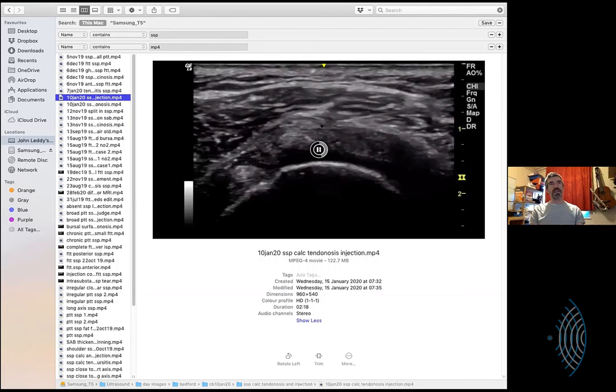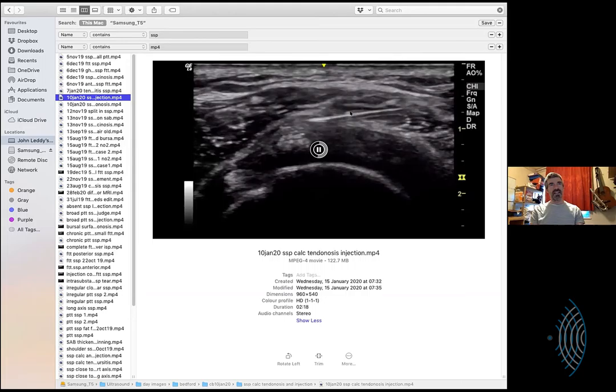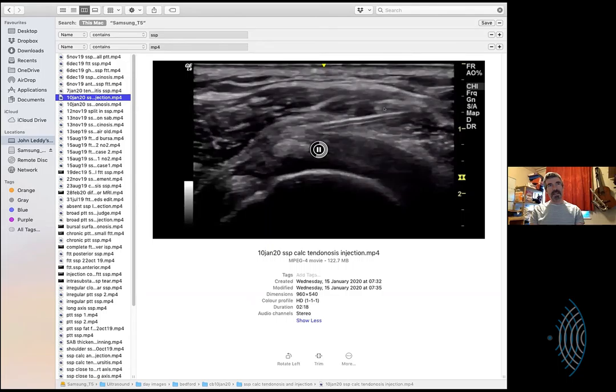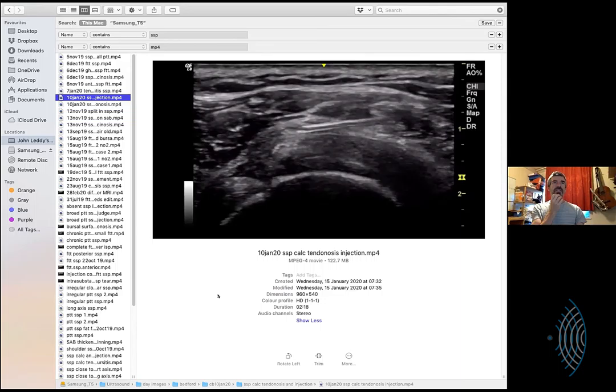And you're breaking through the bursa that's overlying the supraspinatus. I'm trying to find the bursal line, and this is one where I struggled. So I put it where I thought the bursa is, where that needle looks like it's in the bursa. But when I put the fluid in, it accumulates a little bit too locally, and so I'm not happy that that's actually in the bursa. That would mean you're underneath the bursa? No, I'm over the top of it.